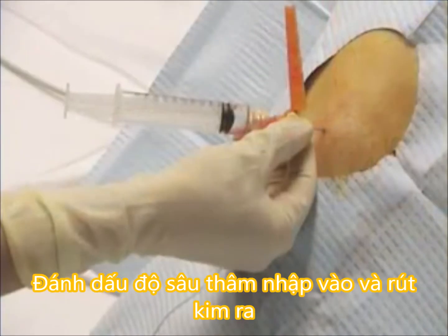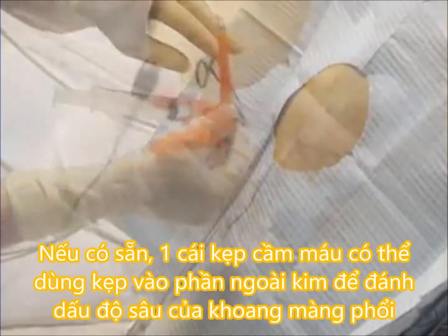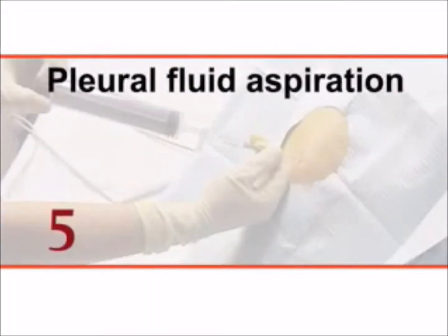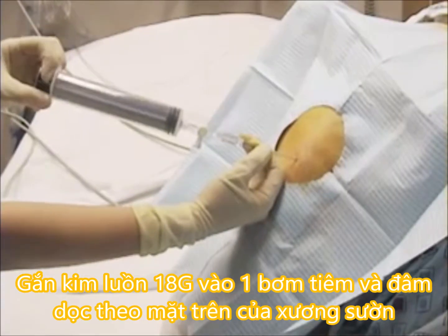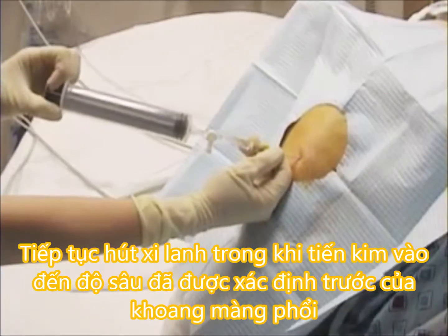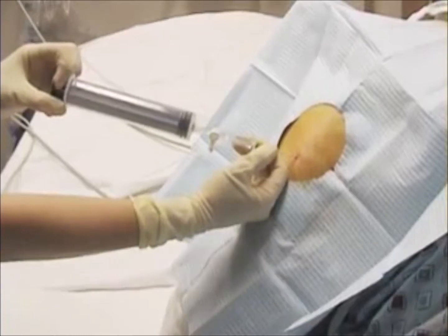Note the depth of penetration and then withdraw the needle. If available, a hemostat may be attached to the exposed portion of the needle to mark the depth of the pleural space. Attach an 18-gauge over-the-needle catheter to a syringe and advance it along the superior surface of the rib. Keep pulling back on the plunger as you proceed to the predetermined depth of the pleural space.